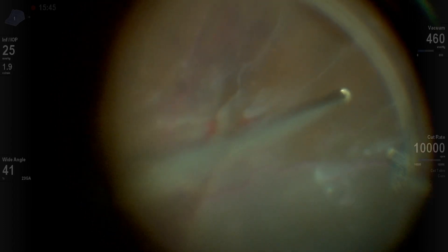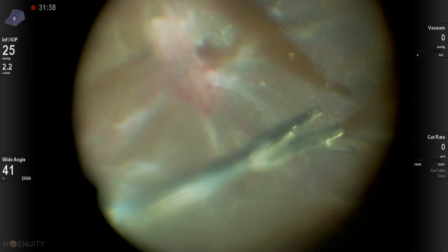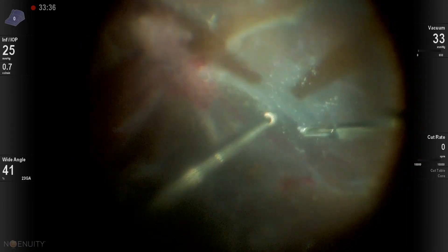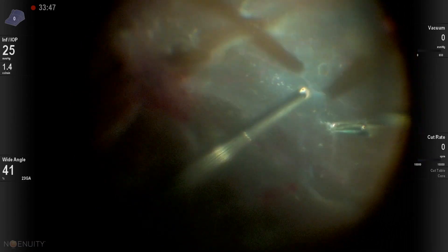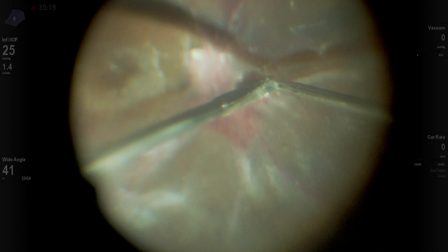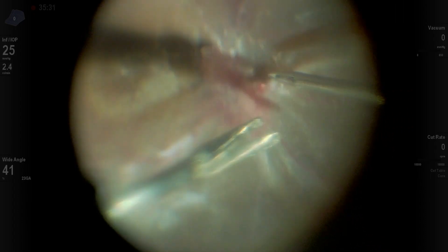Here trimming of the peripheral vitreous that I managed to cut with the cutter. There remains here adherent hyaloid which I was not able to remove either with the scissors or with the cutter. Because the retina is detached I decided to leave that. I tried again from posterior to anteriorly with some success to separate a membrane, but otherwise it was difficult to remove the piece of vitreous that I just commented on.